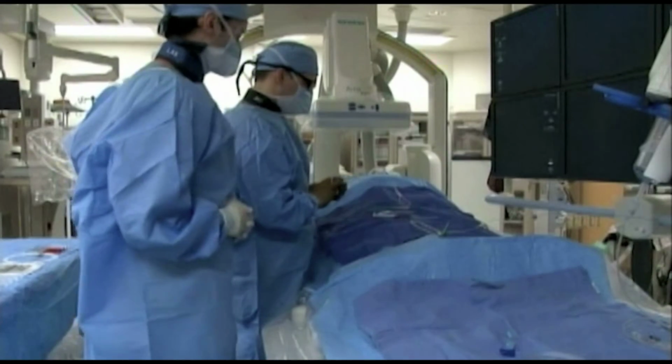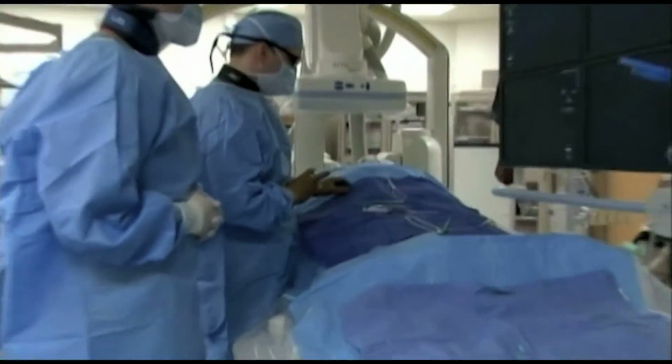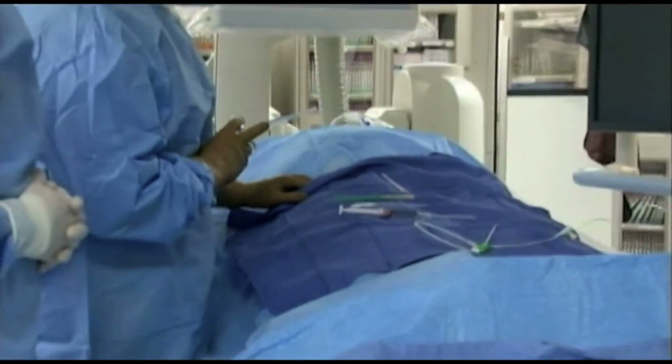A 4 French micropuncture kit is used to access the femoral artery. Unless there is pre-existing vascular disease, the right femoral artery is typically chosen.